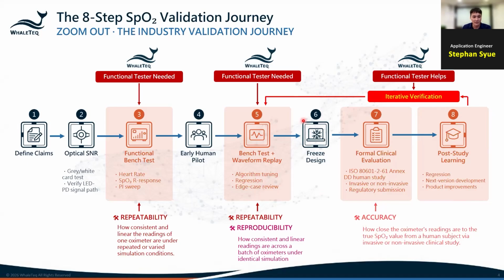Actually, we have a case from a customer in Switzerland. The FDA advised them to add a minor feature for when the signal is low in PI, when the algorithm is not so confident about the reading. So when they detect such a weak signal, they should raise an alarm. To do that, they did two things.